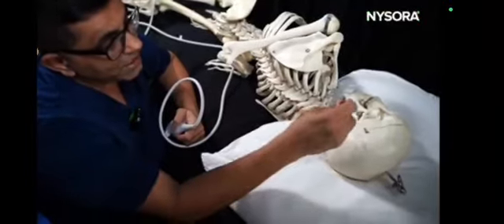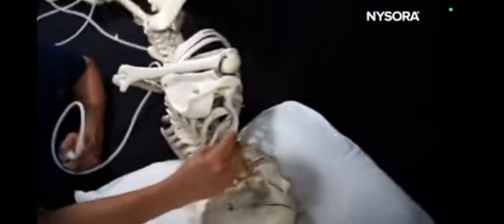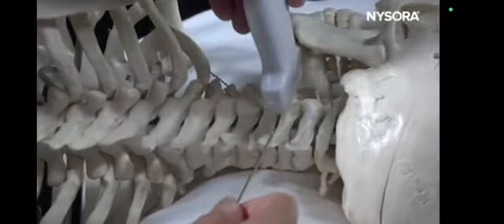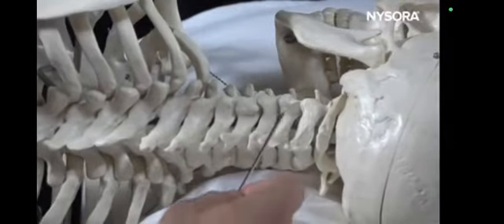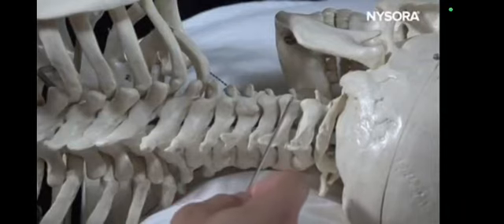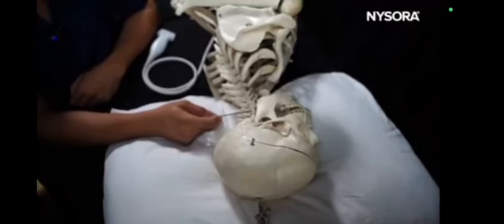The injection technique will be out-of-plane going from anterior to posterior, or you can do a transverse view and go in-plane from posterior to anterior, landing in the area which we call the articular pillar. Then you will use X-rays, if you're performing the radiofrequency treatment, to confirm and fine-tune the position of the needle. Thank you.